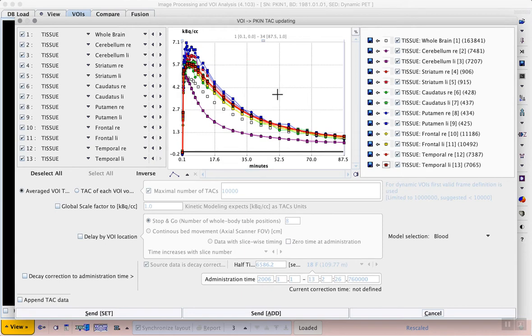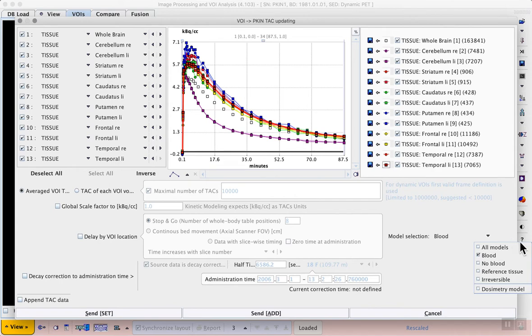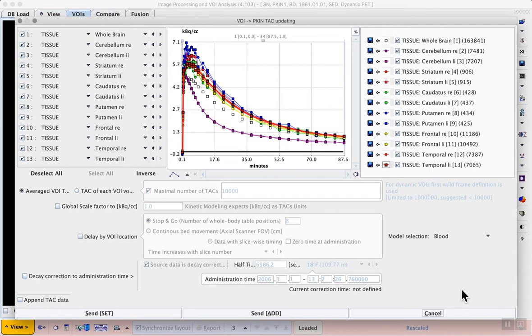The time activity curves are previewed in this time activity curve preparation dialogue. In the lower right we can select the type of models we want to work with in the kinetic modeling tool. In this case the two tissue compartment model falls under the blood based models.